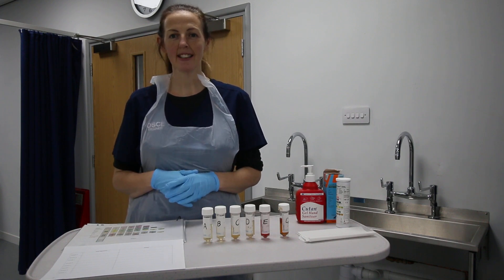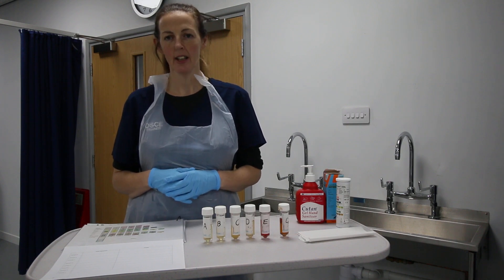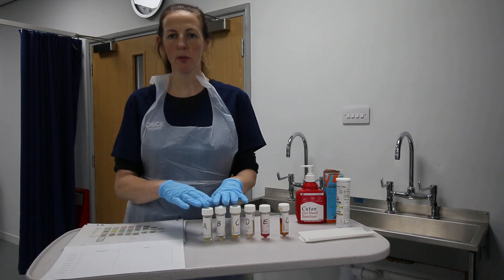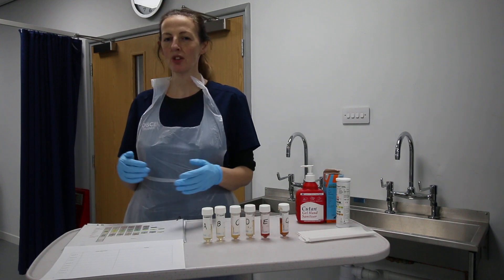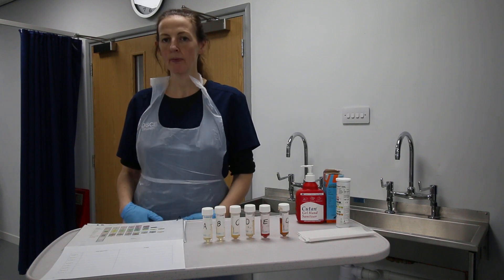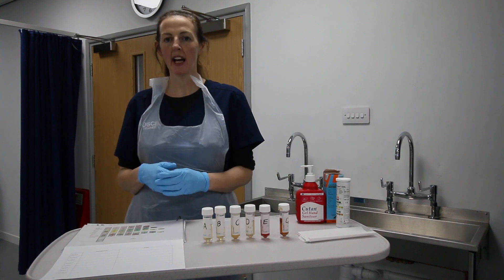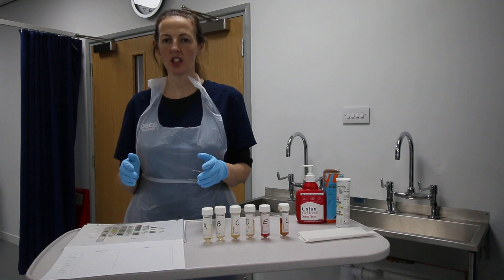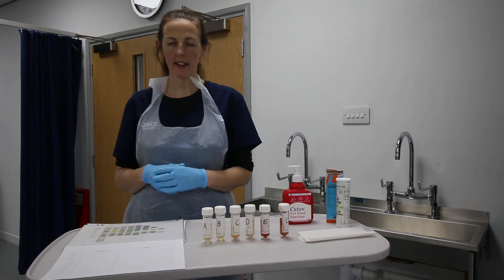Urinalysis is a chemical means of detecting abnormalities in urine, and it's a clinical skill that brings us into contact with bodily fluids. I will be observing correct infection control precautions by wearing an apron to protect my uniform from any splashes, wearing gloves, and gelling my hands before and afterwards as points of hand hygiene.